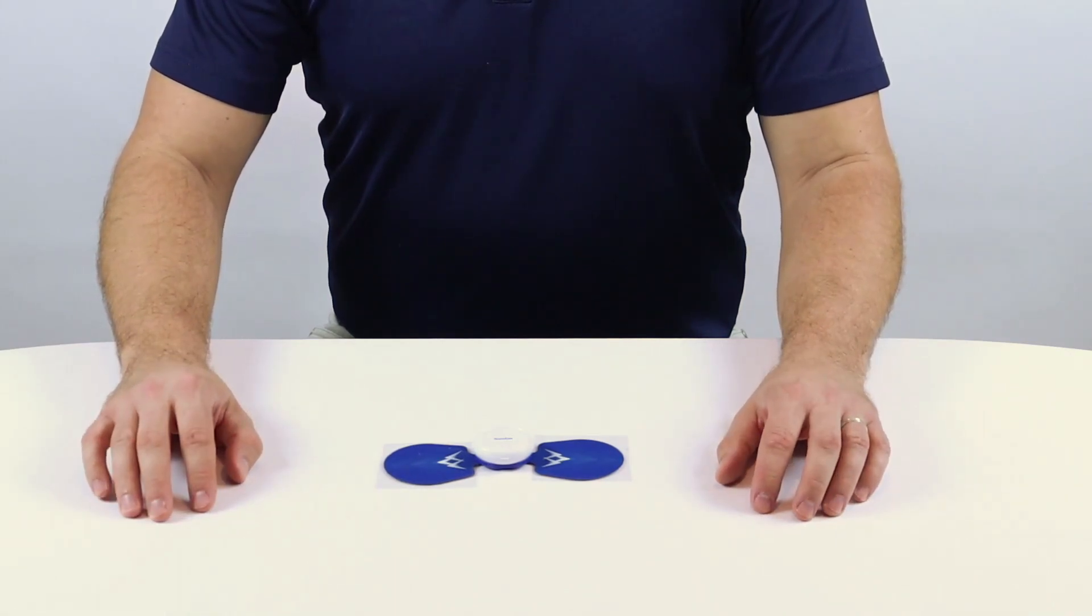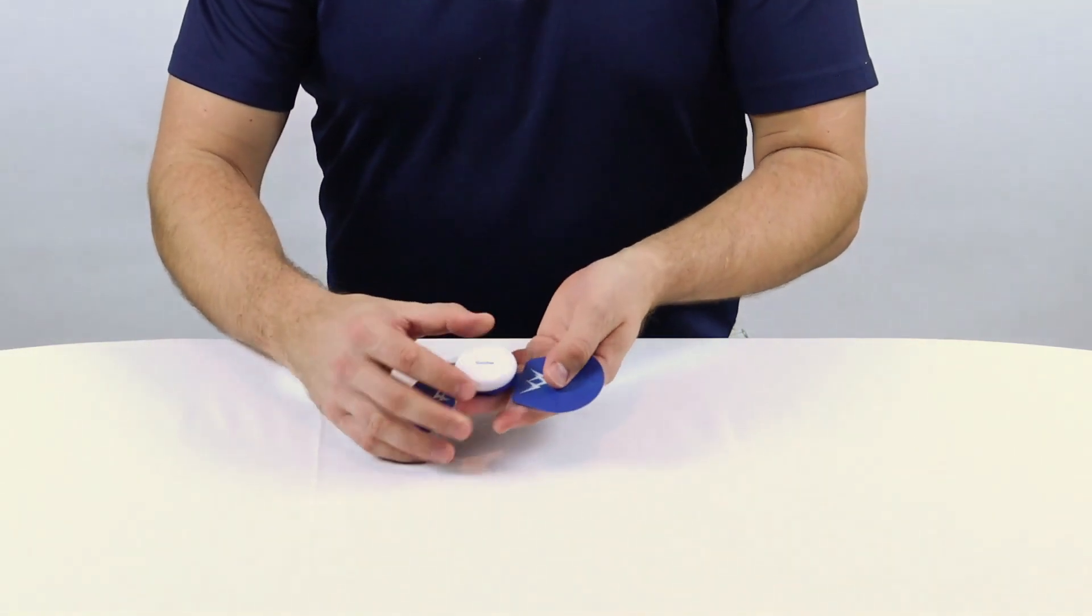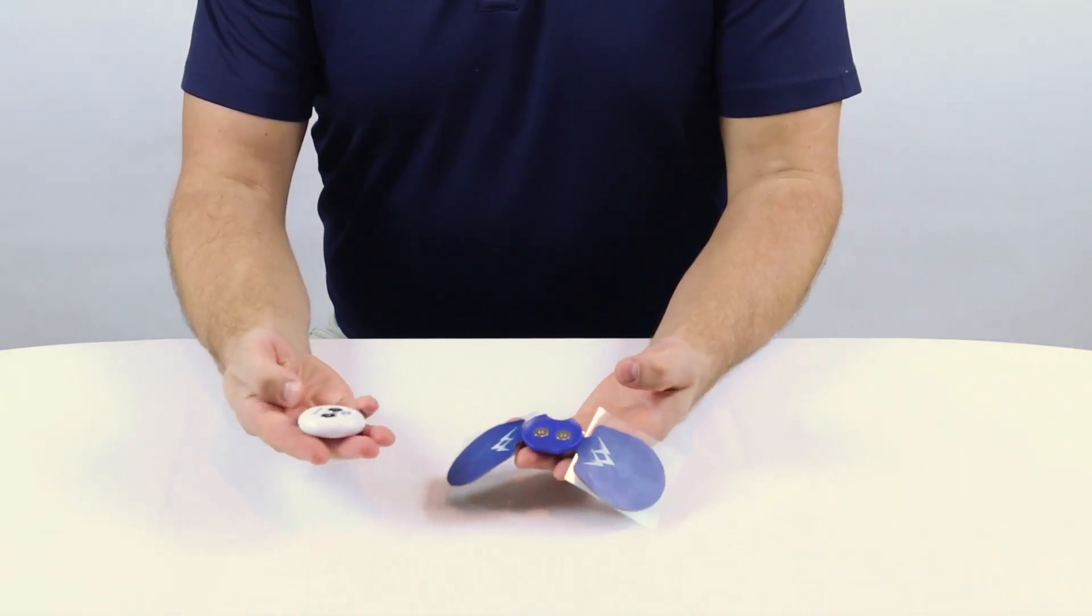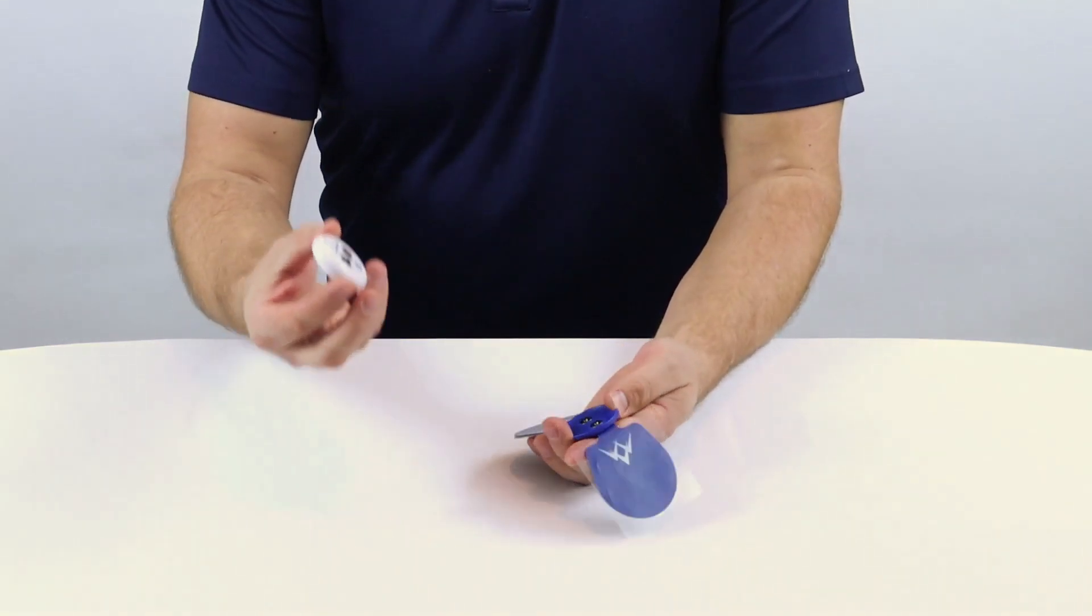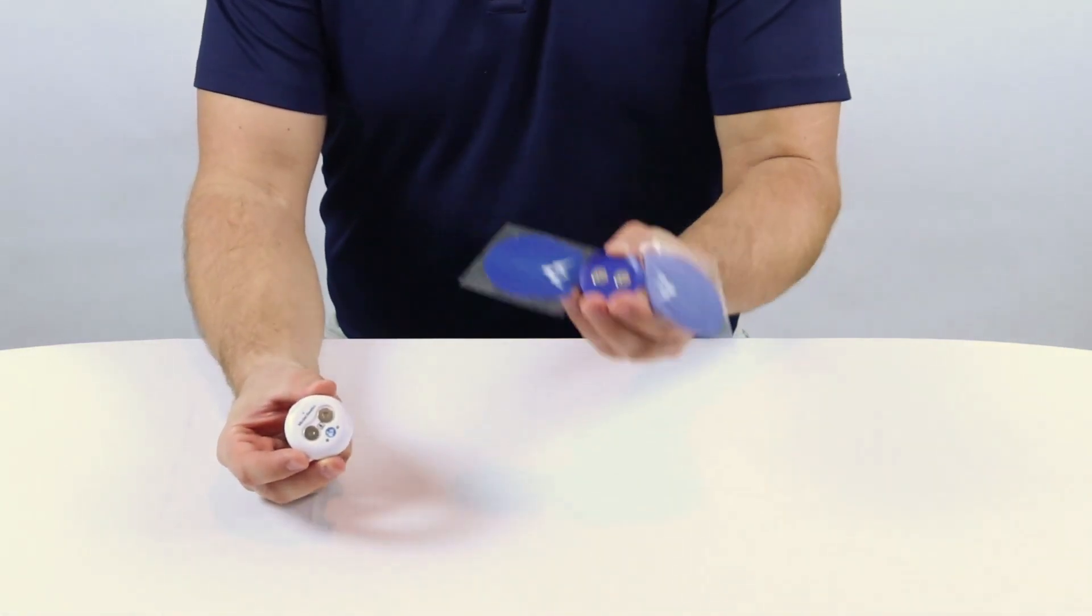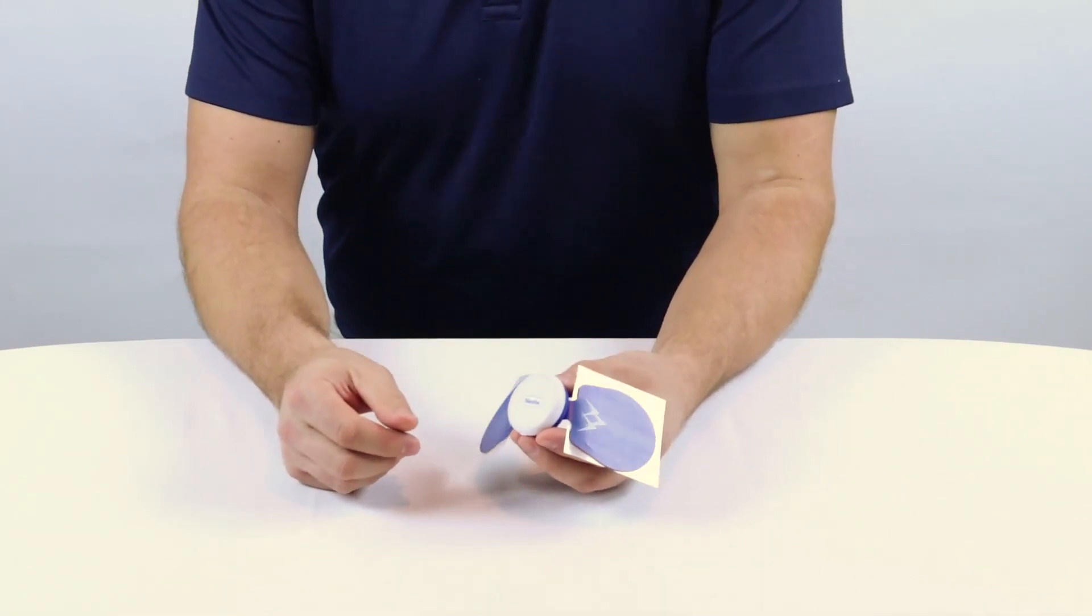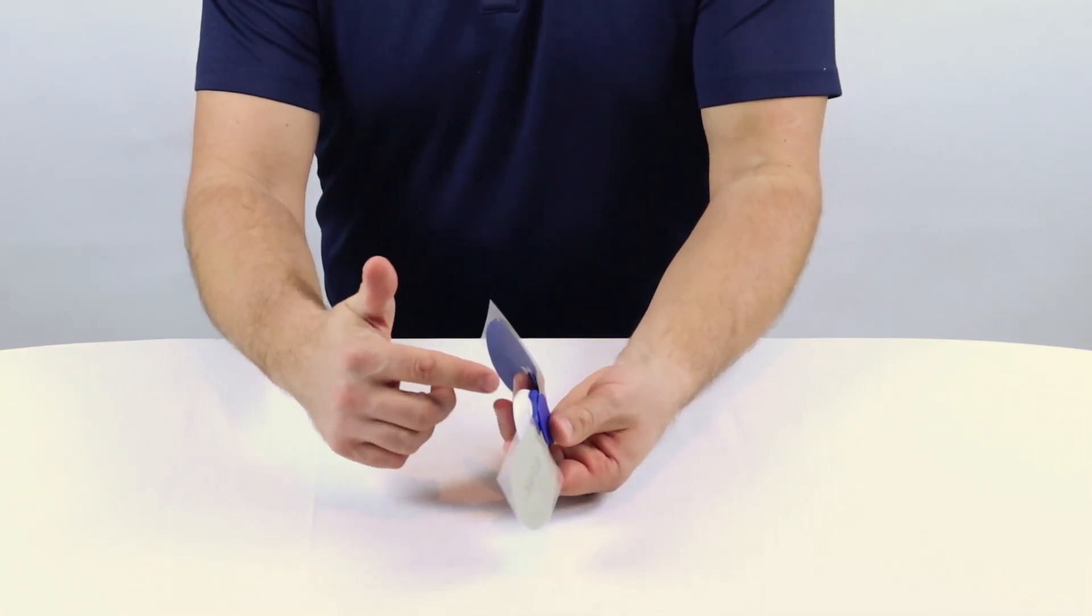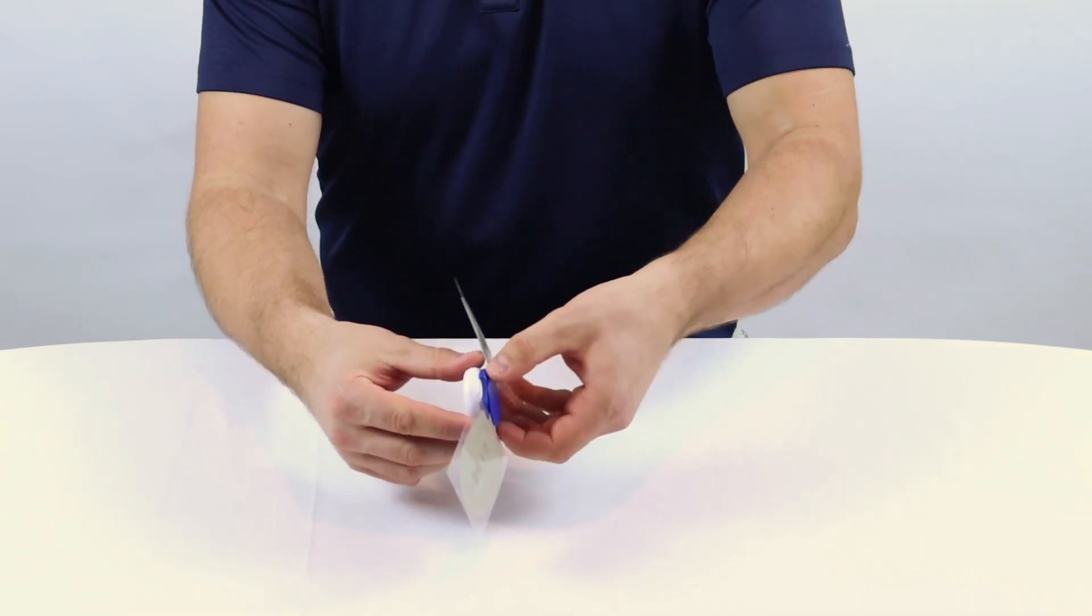One common question we get about the Sabostim Go is, how do I disconnect the electrode wings from the Sabostim Go? The reason you'd want to disconnect the wings from the controller unit is so that you can charge the device. The Sabostim Go is made up of two parts, the controller unit and the wings. These are held together by magnets. To easily separate the two parts, insert your fingernail into the space where the blue of the wings meets the white of the controller unit and pull apart.